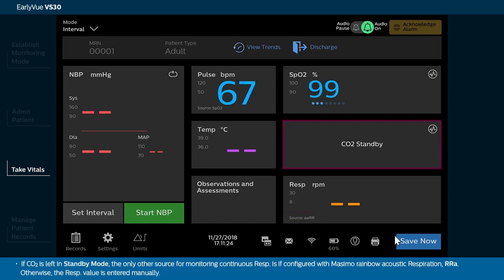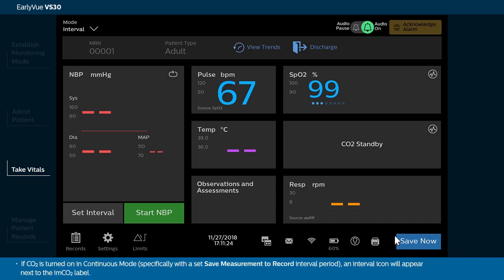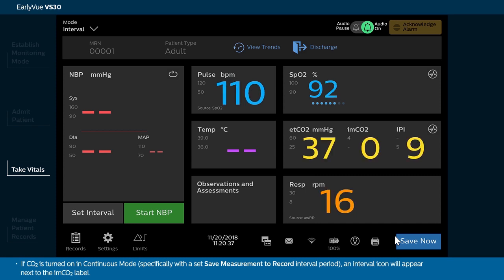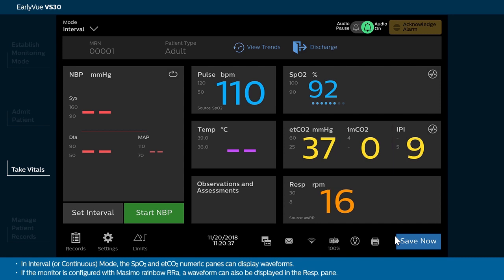If CO2 is left in standby mode, the only other source for monitoring continuous RESP is if configured with Masimo Rainbow Acoustic Respiration, or RRA. Otherwise, the RESP value is entered manually. If CO2 is turned on in continuous mode, specifically with a set Save Measurements to Record interval period, an interval icon will appear next to the IMCO2 label.